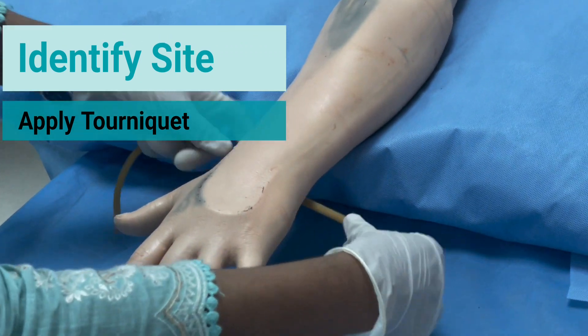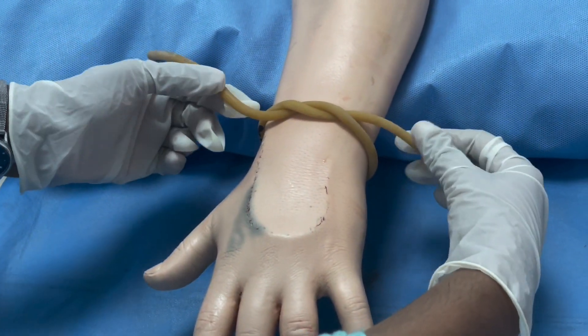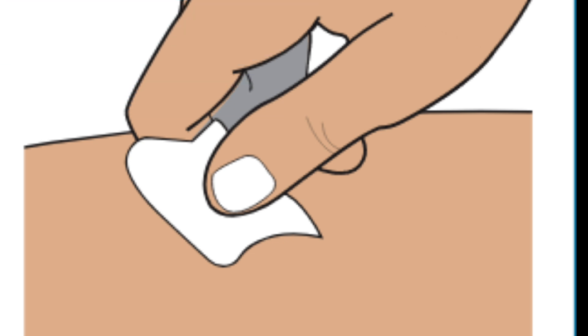Expose the area after identifying the site, and apply a tourniquet 4-5 fingerbreadths above the identified site. Clean the area with an alcohol swab.